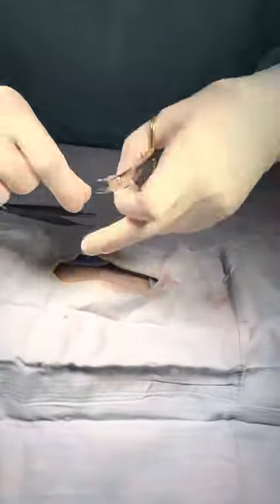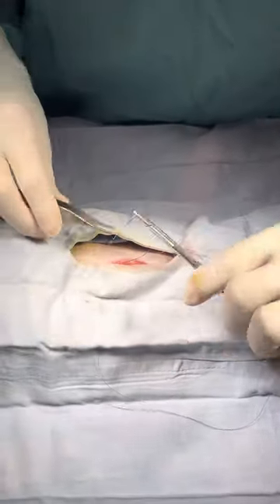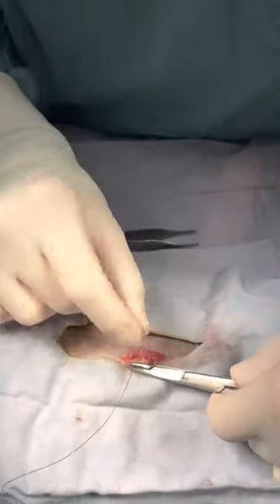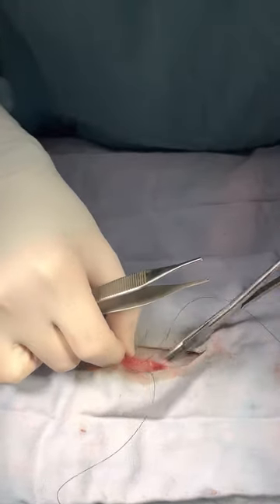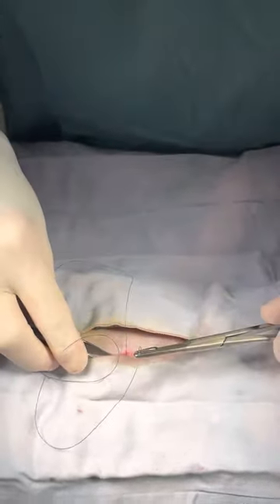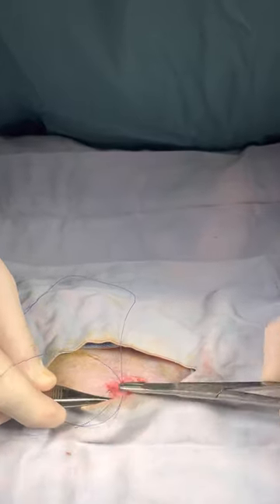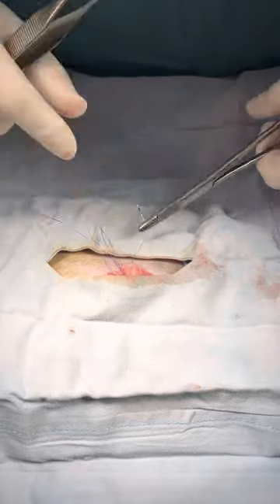Now I'm going to do the sub-Q layer — this is the subcutaneous or fatty tissue — and we'll go ahead and close this girl up. Then she'll be ready to wake up. This particular patient appears to have hip dysplasia, so the owners have asked us to do x-rays of her hips. After surgery, while she is still anesthetized, we'll take her into the diagnostic imaging lab and take a picture of her hips for her owners.